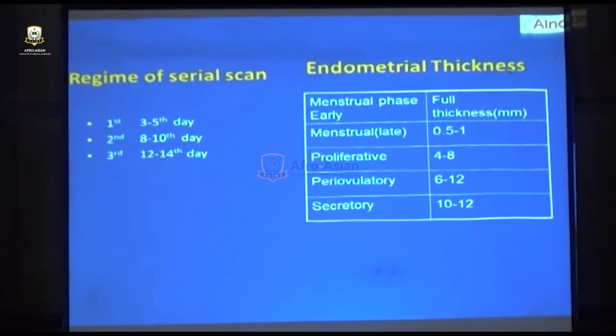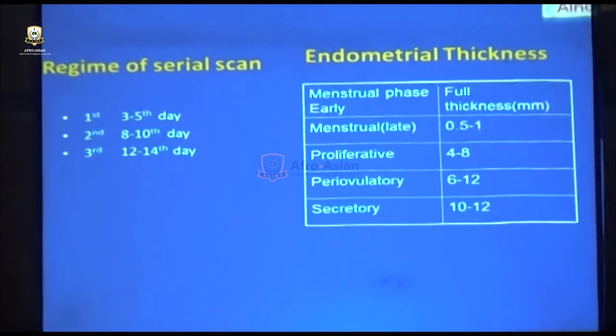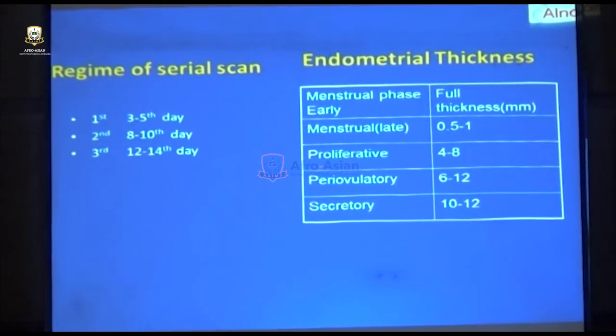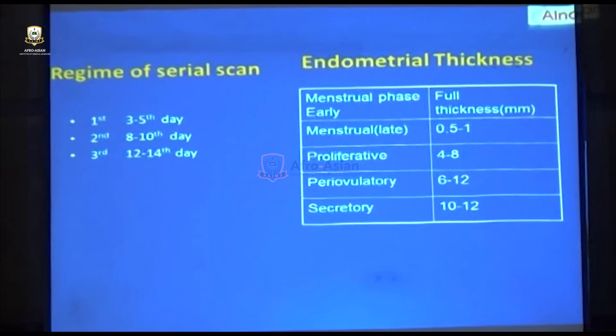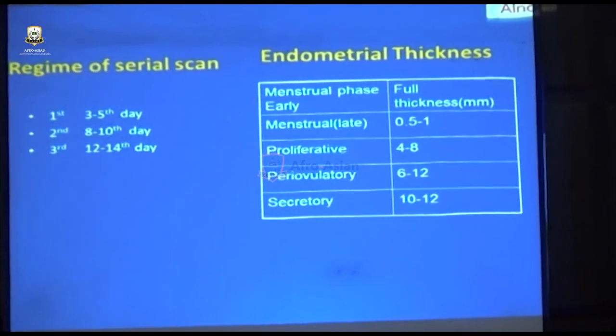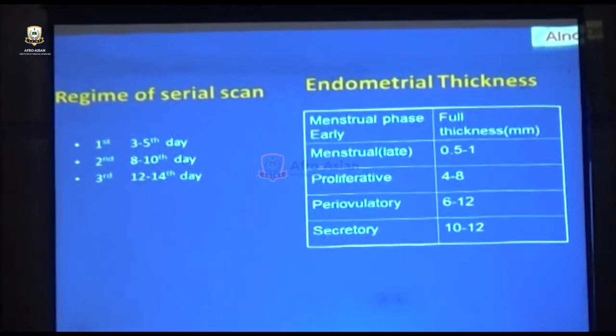And it is not only the follicle, please, please. With the ultrasound, you should not only look at the follicle, you follow the endometrium. Because the endometrium is where the fertilized egg is going to implant. If the endometrium is not accordingly grown, the follicle is altogether useless. I'll show you the images of how important this is.